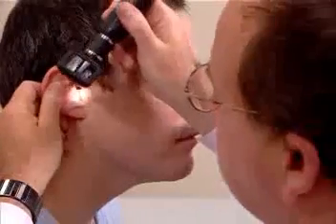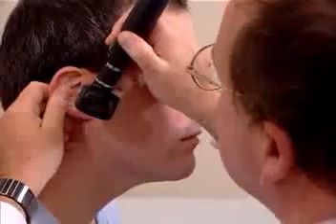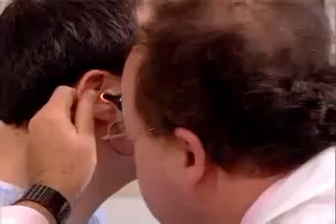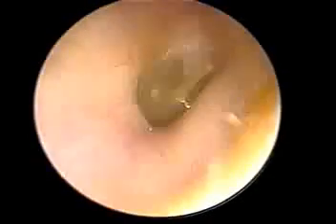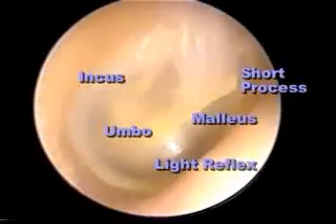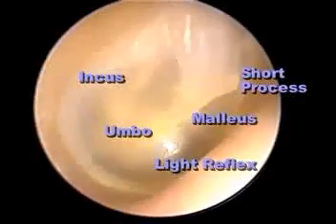The most important part, though, is pulling up, out, and back to straighten the canal. In doing such, you will straighten the canal, place the speculum into the external auditory canal, and visualize the external canal and the tympanic membrane. You'll notice the malleus, the umbo, the light reflex pointing anteriorly, and perhaps other ossicles in the middle ear.